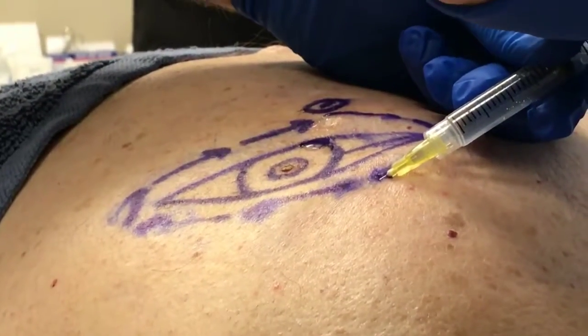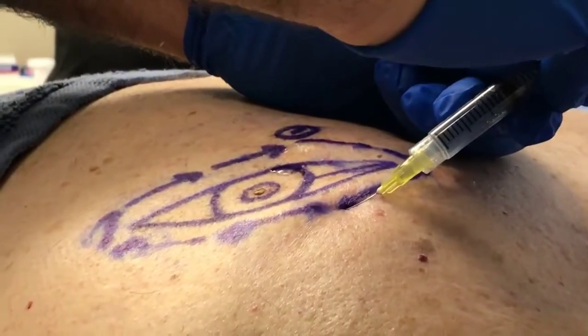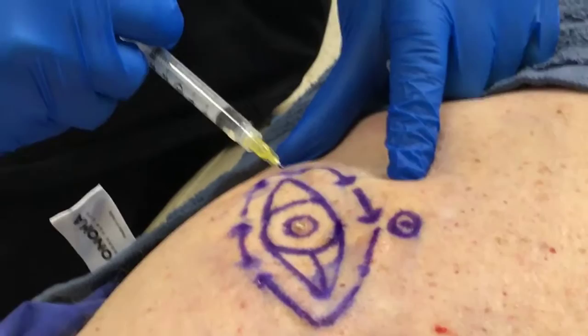The anesthetic is delivered 1-2 cm around the actual lesion and completed in a 360-degree format. This allows for a complete field effect to be accomplished.